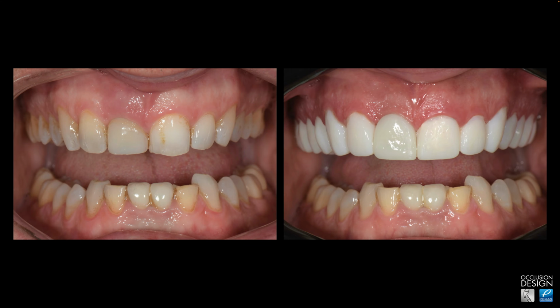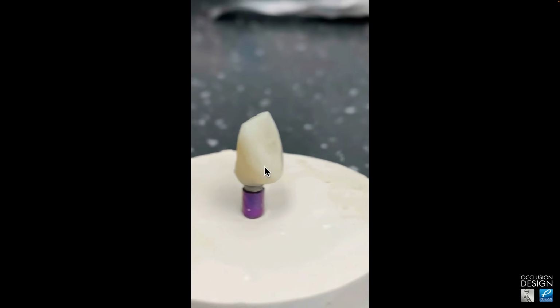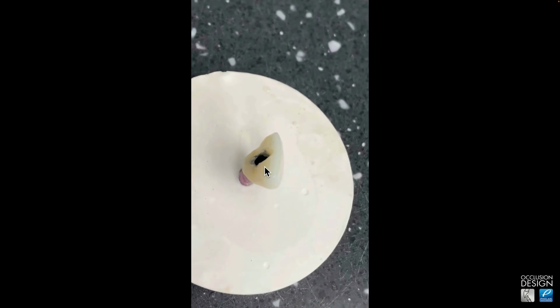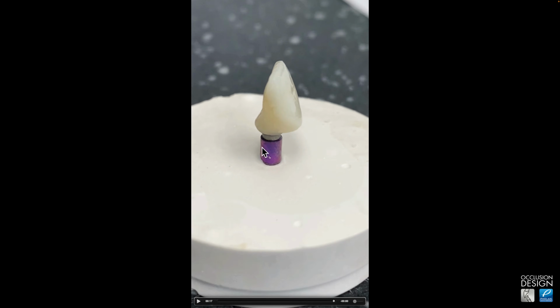So you can see the before and the after. So he was okay, came in the next day, and we start the day 2 preps. This just shows you the veneered provisional crown. So all I did was I basically glued with flowable composite a Pro Temp provisional that was made from the wax up design and made in the shell of the other provisionals. You can see this is not as deep as we would like, and it has a pretty abrupt emergence profile because it's not placed as deep as we would ideally like that implant crown.